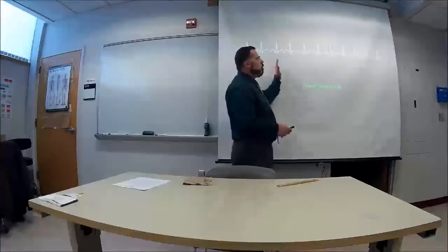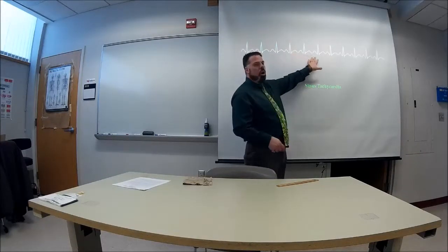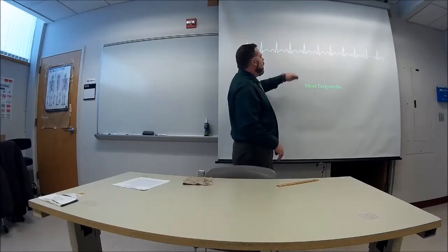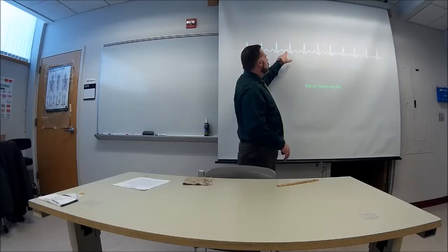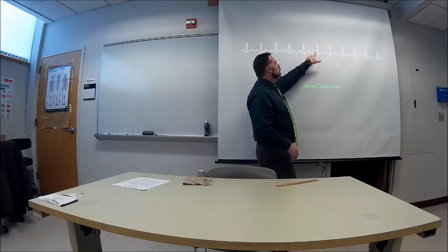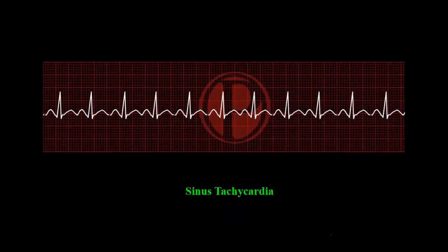I'm not going to ask you how to figure out the heart rate, it's AP2 stuff, that's old stuff. But what I would ask you is, if I give you this, is it sinus or not? So here's a P, here's a QRS, that's a T, P, QRS, T, P, QRS, T. So for every P wave, there's a QRS complex.